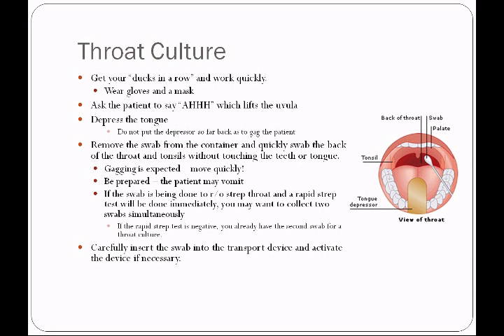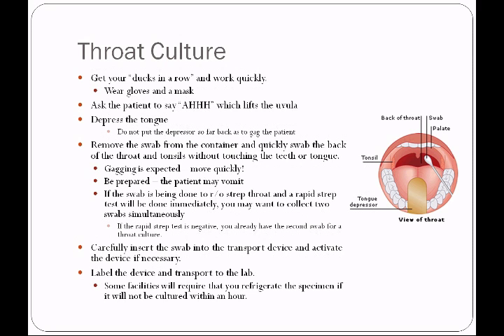Carefully insert the swab into the transport device and activate the device if necessary. Label it and transport it to the lab. Some facilities will require that you refrigerate the specimen if it is not cultured within an hour. Some laboratories do not want throat cultures refrigerated because Streptococcus pyogenes tends to be rather sensitive to cold temperatures. So definitely check with the procedure manual where you are working.